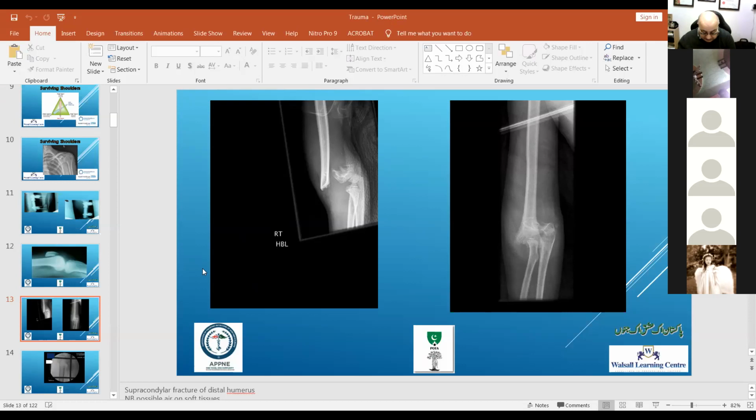Sir, it looks like 4 because the humerus is tenting the skin. It's coming out from the skin. Yeah, I think so, but don't commit yourself. In the exam, you will say this is an X-ray of a skeletally immature child showing an elbow fracture. This fracture is posteriorly displaced, of the extension type. Now, if the examiner wants to ask you what the Gartland classification is, then you tell them. Otherwise, you don't volunteer information that you don't have to.